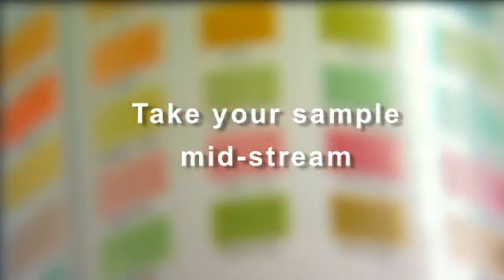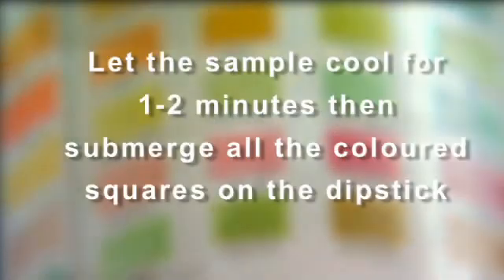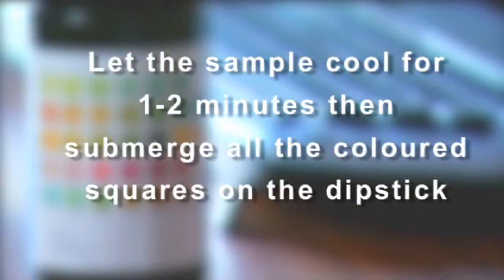When collecting your urine sample, be sure to do this midstream, as this will provide you with the most reliable results. Let the liquid cool for about two minutes, and then submerge all of the colored squares on the dipstick.